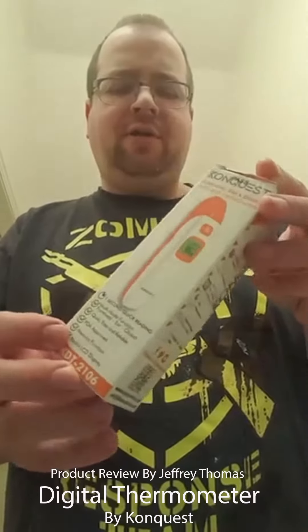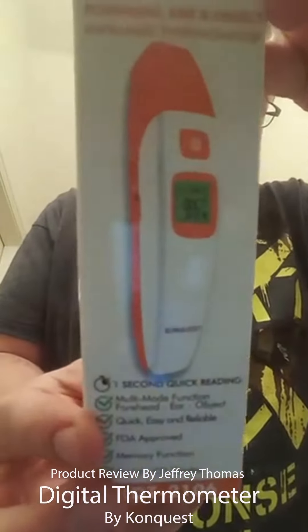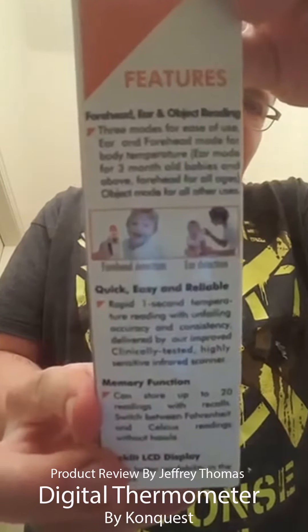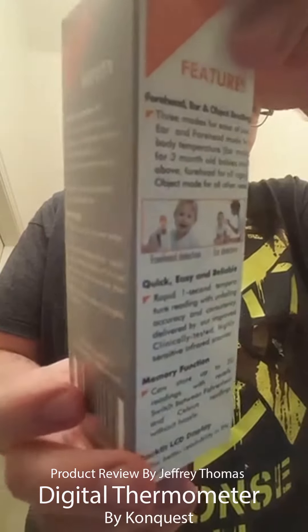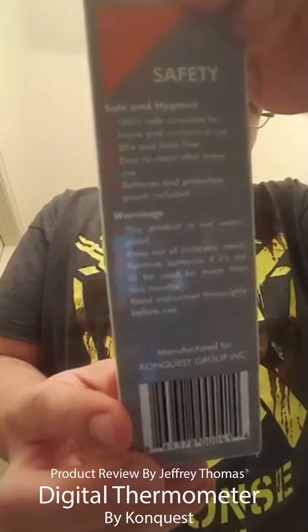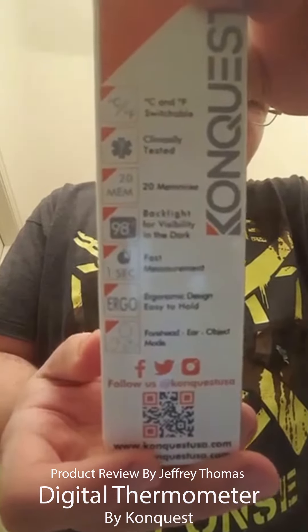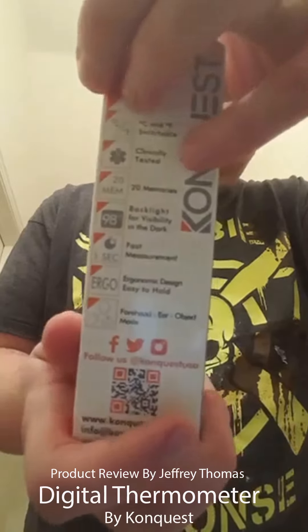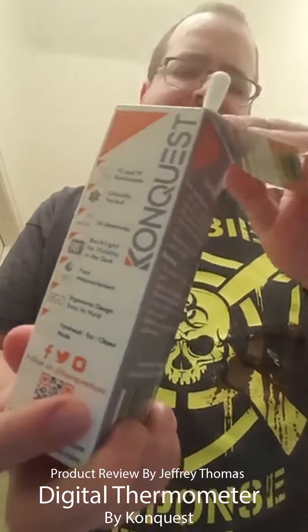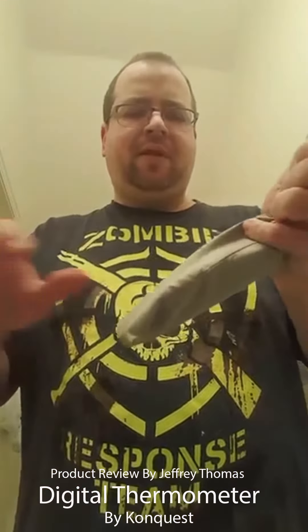Today I have for you a digital thermometer that reads both forehead and ear — it's a really nice item. You can see the box here. This will allow you to take a forehead temperature when someone's sleeping or when they're kind of out of it when they're sick. It'll also allow ear temperature, or forehead if somebody's ear hurts, depending on what they might prefer.